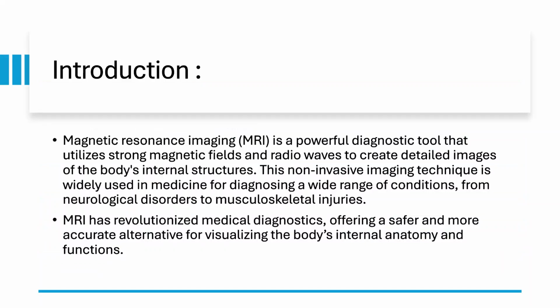So MRI is a powerful diagnostic tool that utilizes strong magnetic field and radio waves to create detailed images of the internal structure of the body. It is a non-invasive imaging technique, and it is widely used in the medicine industry for diagnosing a wide range of conditions from neurological disorder to musculoskeletal injuries. MRI has revolutionized the medical diagnostic, offering a safe and more accurate alternative for visualizing the internal structure and anatomy of the body.